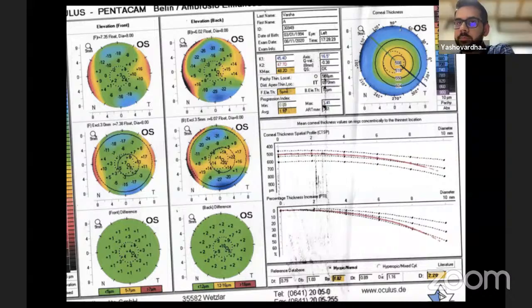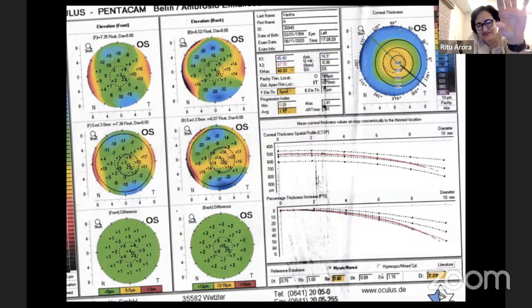So it may not be an overall ectatic cornea. Right. So right now, all we want as examiners, when they're asking you, is whether you know the different parts of the map, but also it is very important to understand that you are not going to give a diagnosis just based on this. If it is clear-cut, you give a diagnosis, and if not clear-cut, then you stay like that. In keratoconus suspect, doubt and all, but I would like to see the patient clinically and confirm, that will actually give you brownie points with the examiner.